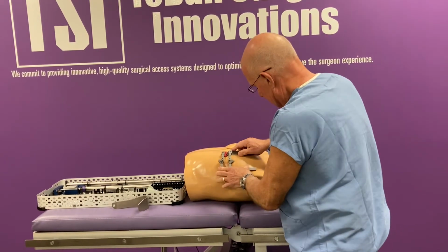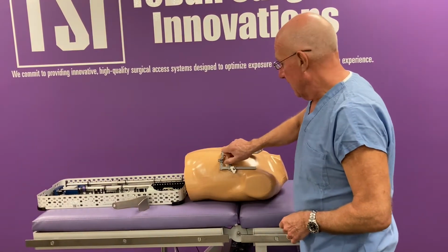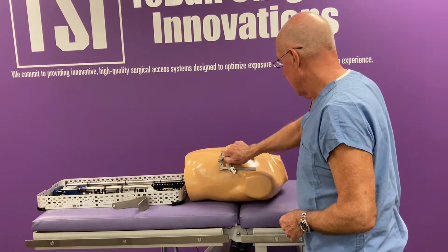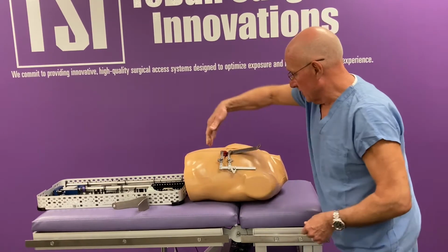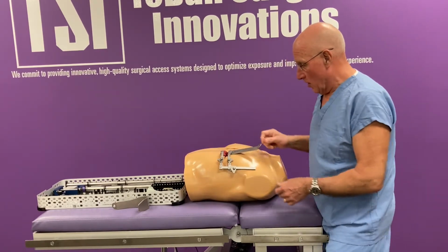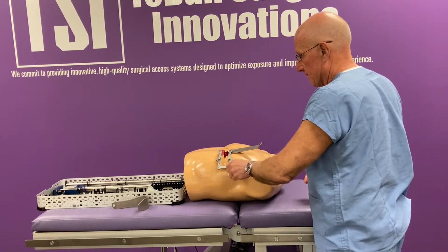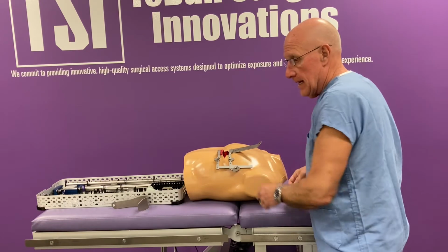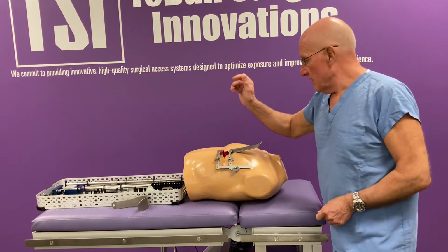Okay. Now before we retract, we're going to go ahead and take the pivot and pivot the lift blade all the way, and this is going to bring it up against the chest wall. All right, now we're ready to retract. At this point, we're ready to lift, so we're going to take out the balance of the lift system.